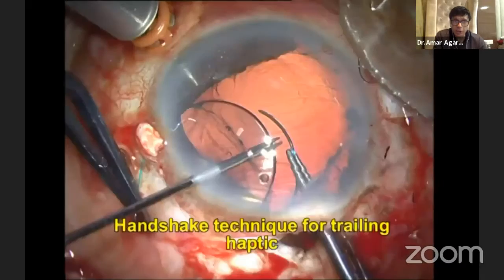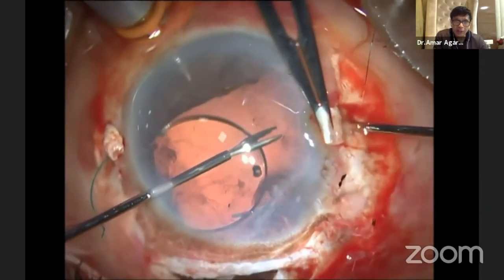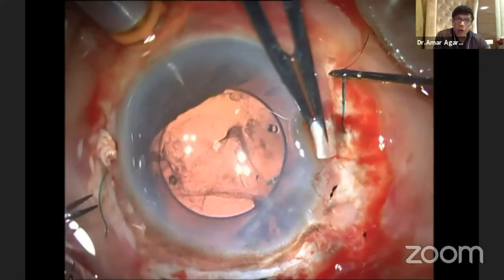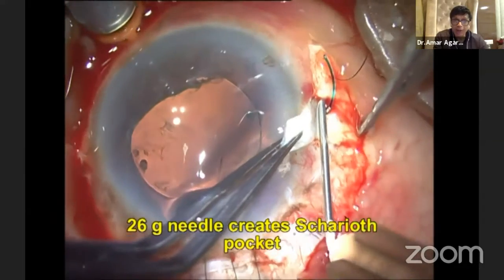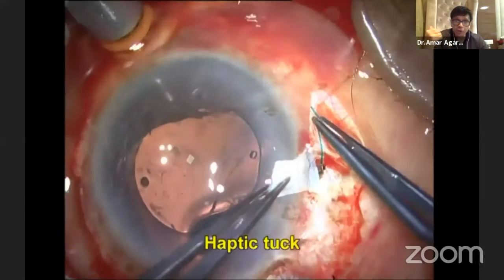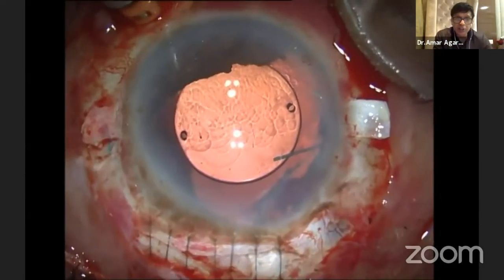So I implant the first haptic using the handshake technique. The second haptic is out. Notice carefully how much haptic is out — this is a key step in intrascleral haptic fixation. You need to have a lot of haptic outside, so don't go very posterior. Then tuck the haptics into the 26-gauge scleral pocket.